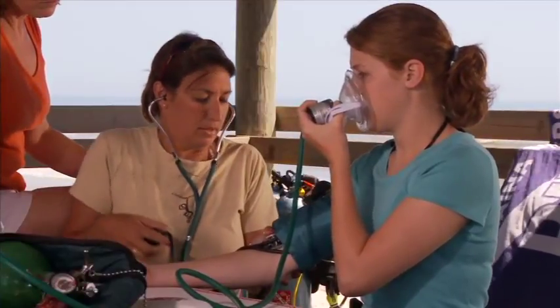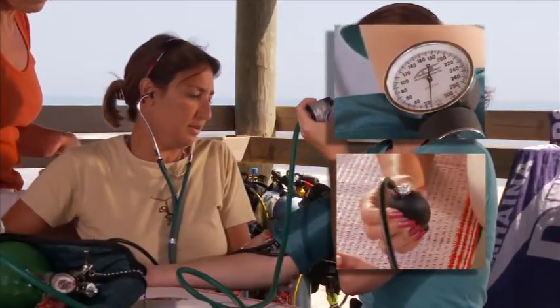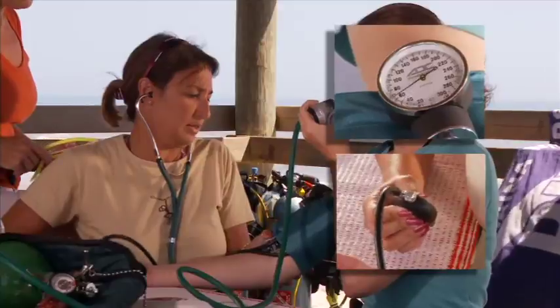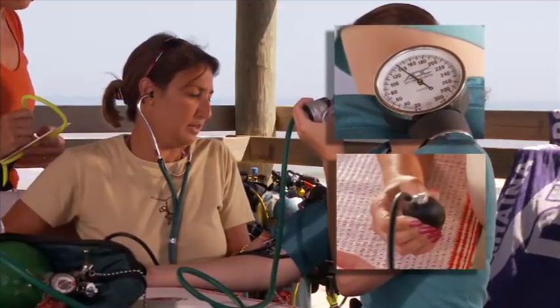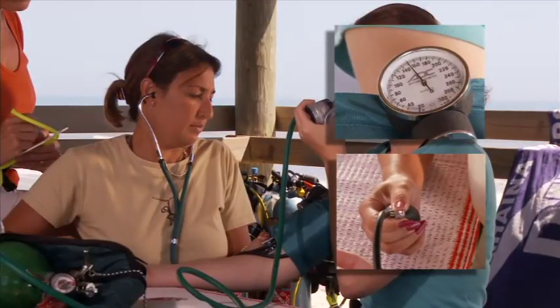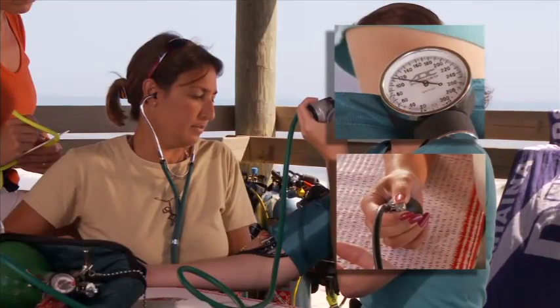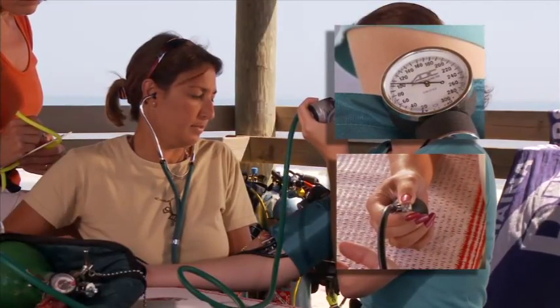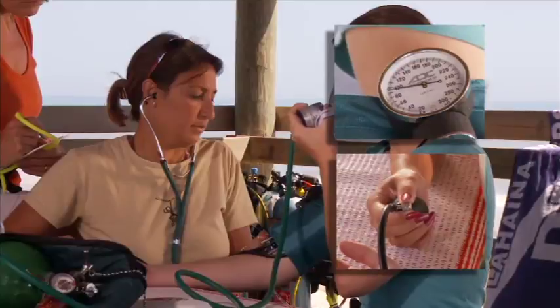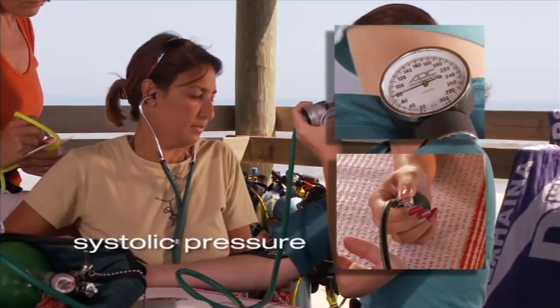Listen through the stethoscope while you inflate the blood pressure cuff, and continue 30 points past where you can no longer hear the brachial pulse. Deflate the cuff slowly, about two points per second, as you watch the pressure drop in the gauge. As soon as you hear two or more consecutive beats through the stethoscope, record the pressure. This is the systolic pressure.